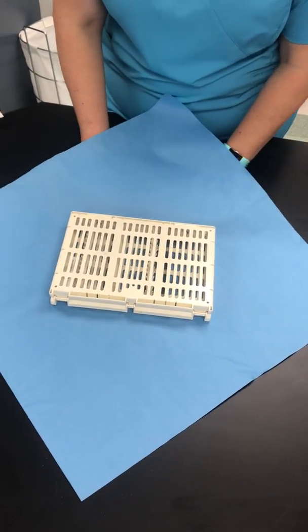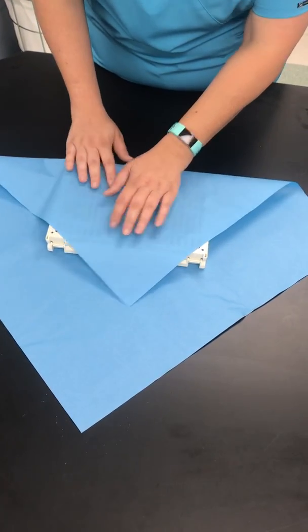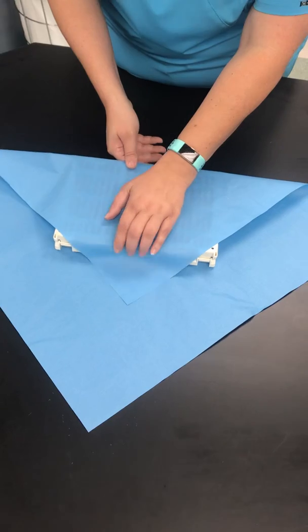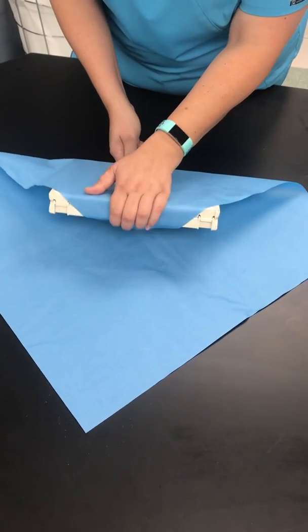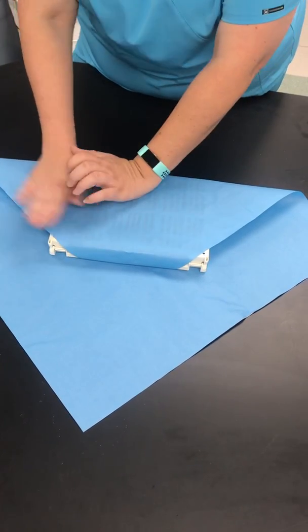So you want to fold up the bottom, hold the tab underneath, and then next you're gonna work on the wings on the side.